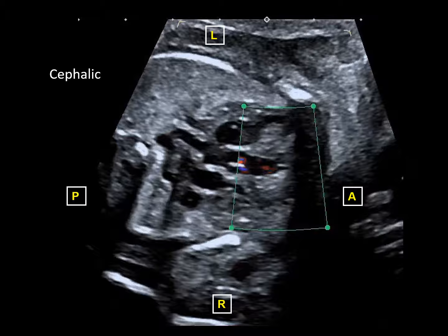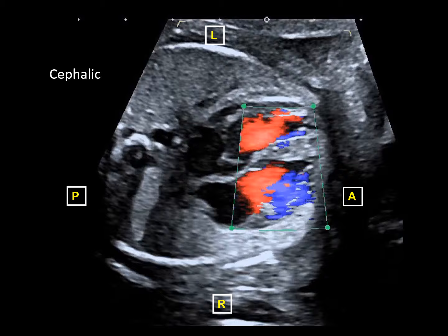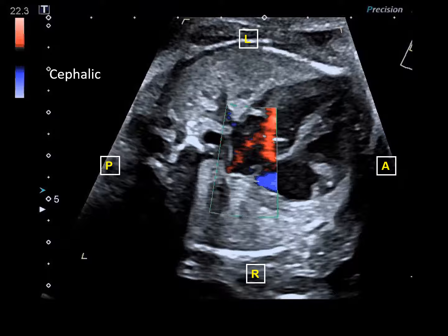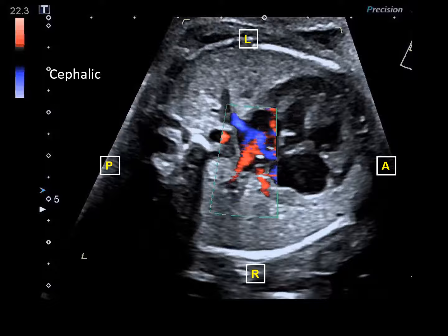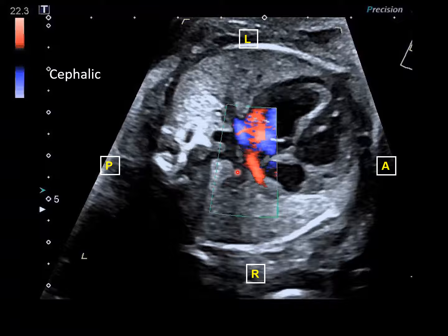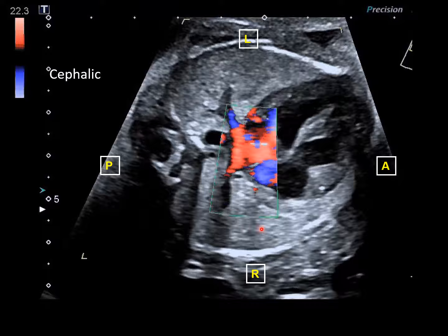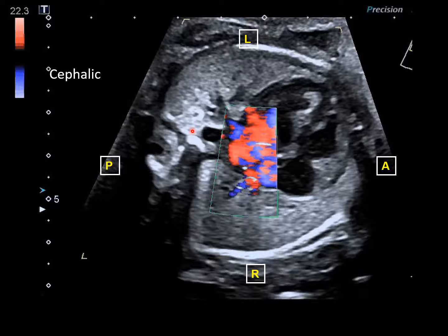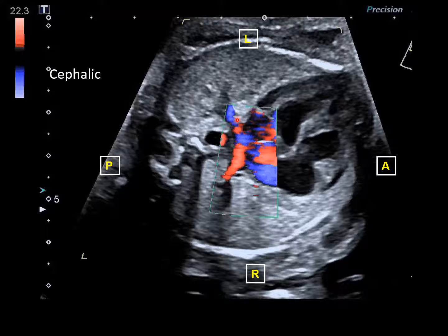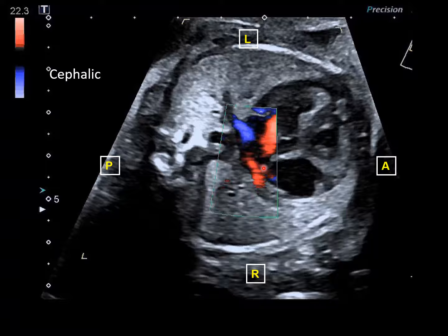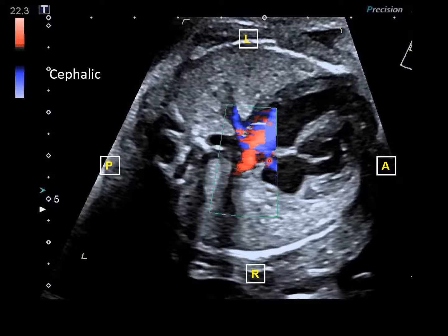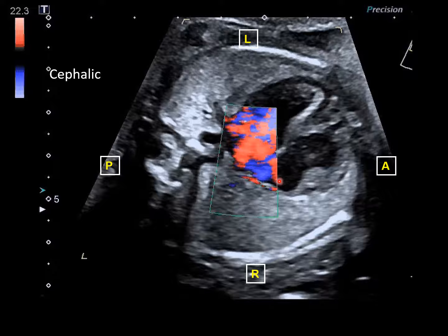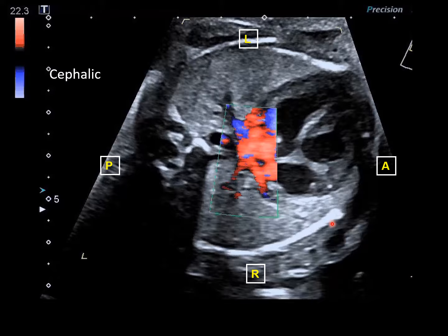With the color scale turned very low, this level is good to detect any elusive smaller defects near the apex of the heart, along the length of the septum. Perform nice slow sweeps down toward the diaphragm to evaluate for any ventricular septal defects, then back up through the heart all the way to the outflow tracts — a slow sweep from the diaphragmatic surface keeping the box in place. Back up to the atria, use this low-scale, low-Nyquist-limit color Doppler to evaluate pulmonary venous drainage into the left atrium. Three pulmonary veins are shown here: two right veins draining from the right lung and one left pulmonary vein. The normal right-to-left atrial shunting through the foramen ovale flap is shown as red flow — this is the normal shunting pattern in a normal fetal heart.